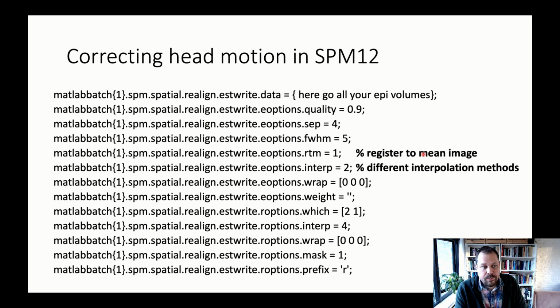Good. Then finally, you can also correct head motion using MATLAB batch scripting. Something I just want to mention. If this is what you want to try, then you can use MATLAB batch scripting, and there are many tutorials on how to use this online. Let me know if you want to give this a go, and I'll give you the link to this.